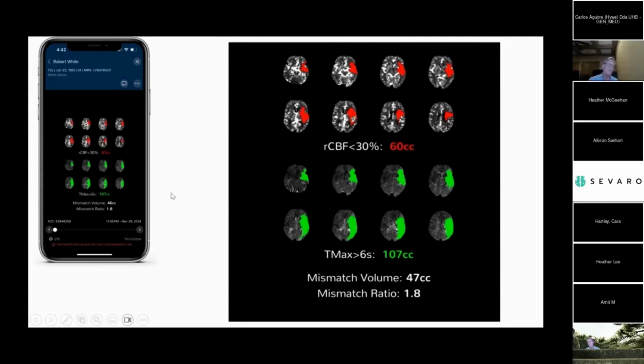What's kind of cool is they have this, and Rapid does as well, and maybe the other vendors have an option to look at images on the phone. I don't know if you guys have done this, but they're outstanding. I don't dictate reports reading off images off the phone. However, I have been on the road, I've been contacted by folks to look at images on my phone, and I can easily make the diagnosis. It's a really nice option.